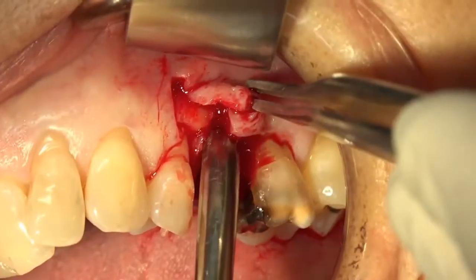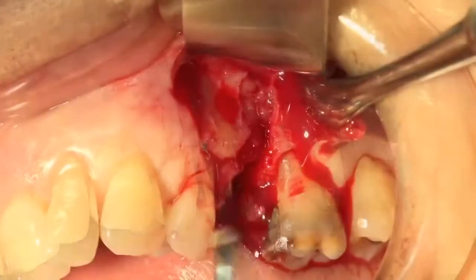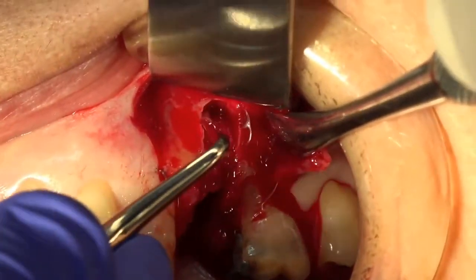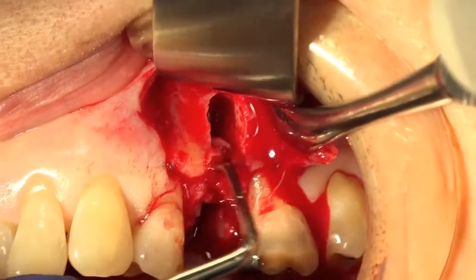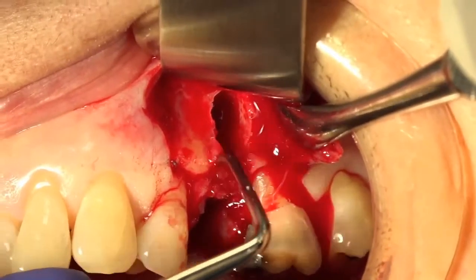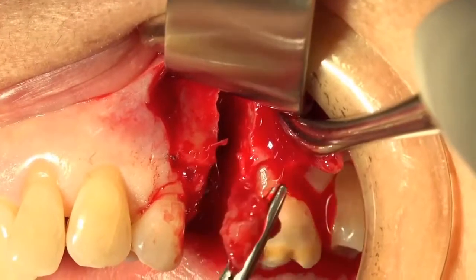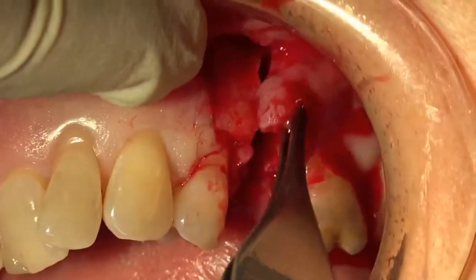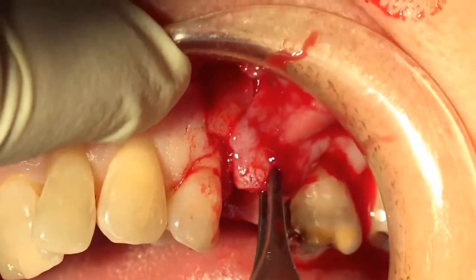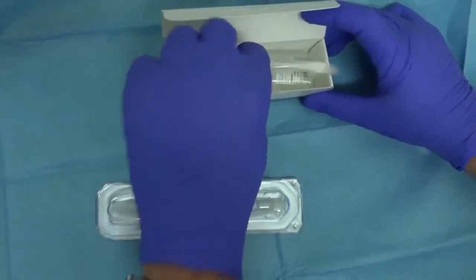However, here we don't need a tension-free primary closure. Therefore, we don't do any horizontal dissection into the flap. Now we remove the granulation tissue and perform a complete debridement within the socket. And we stretch the soft tissue in order to see how much we can gain just by the mobility of the mobile mucosa.